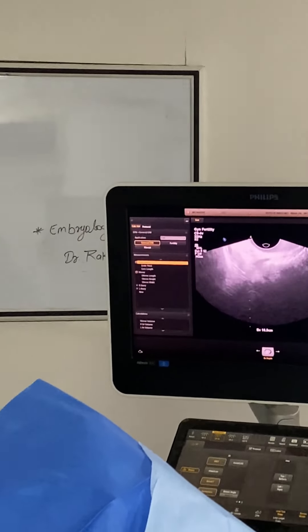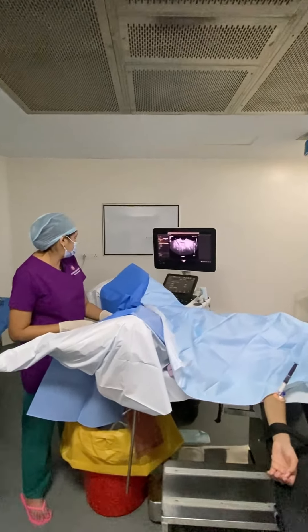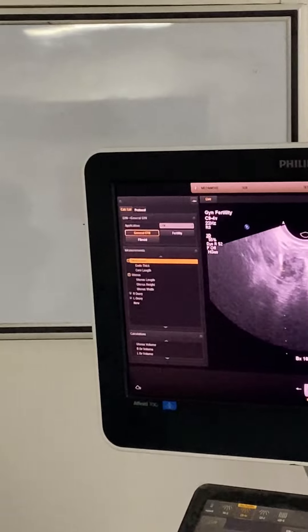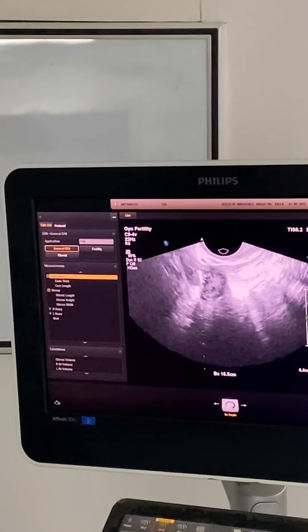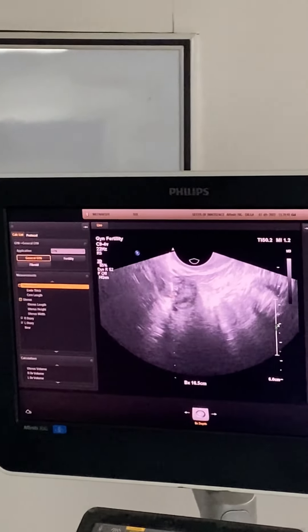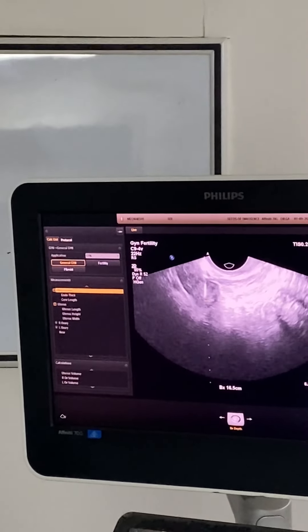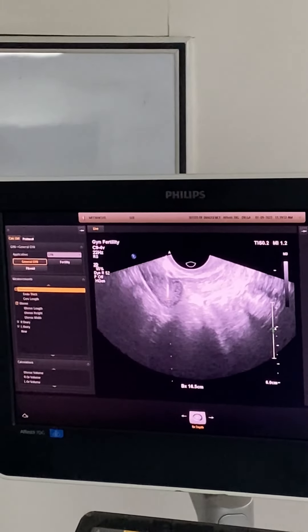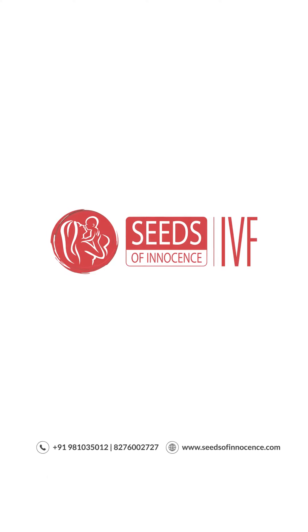Now we will do it to the other side — the second ovary. Can you see the fluid there? We again change the position. This is how we do an ovarian PRP procedure.